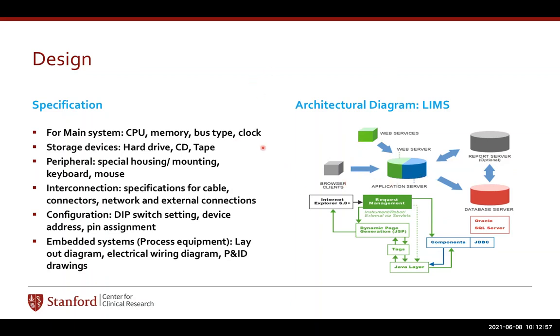And when you look at all the things, there are various layers in a software. What we see daily is only the user interface, just the display. What is happening in the background, we do not know. So this is the background, how the web server is feeding into the application server, or how the client is communicating. Client in this case is us, like users that are doing things on the computer. And then we generate a lot of reports. Of course, that will go to some kind of database, and then you can call the report. So there is a two-way communication, et cetera, et cetera. In a nutshell, what I'm saying is that what you want is being fetched to you, but this is some of the simplistic view to show you what is happening in the background.